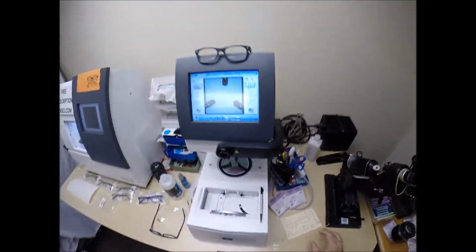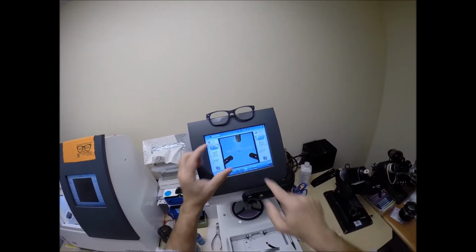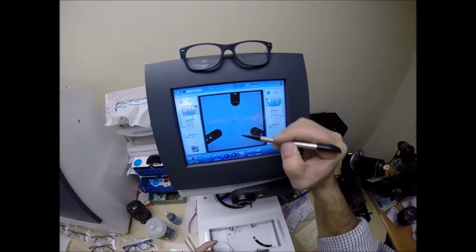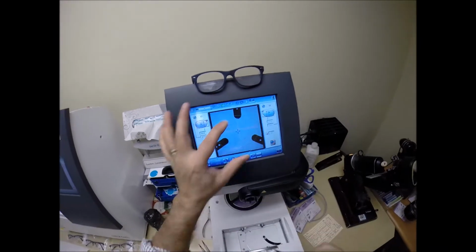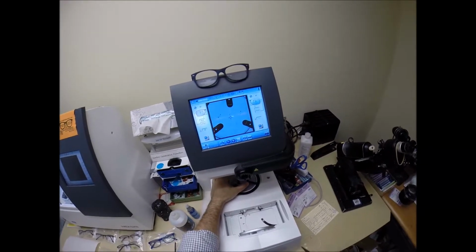I love that joke. Okay, the reason why I put those 3 dots on there, it tells me the lens is oriented in there perfectly. That orange crosshair, just like the crosshairs of a scope, we measure vertically and horizontally. And those 3 dots tell me that it's lined up perfectly. I'm going to place that onto the platform.